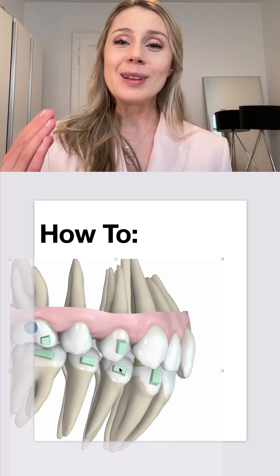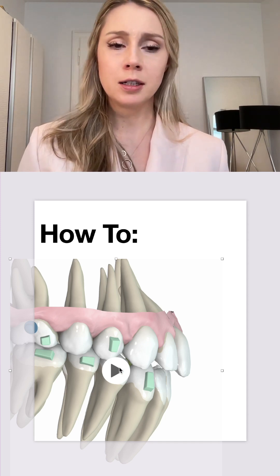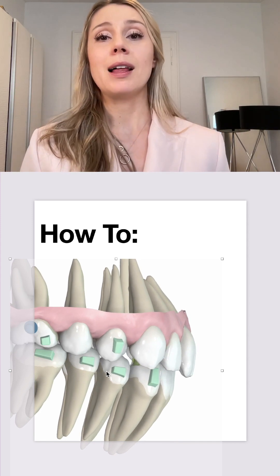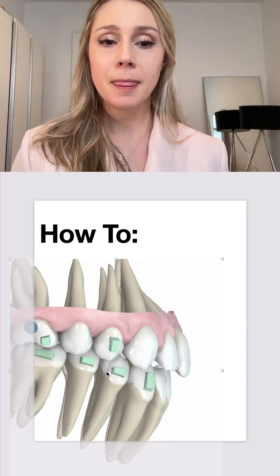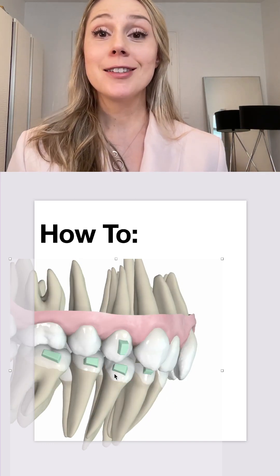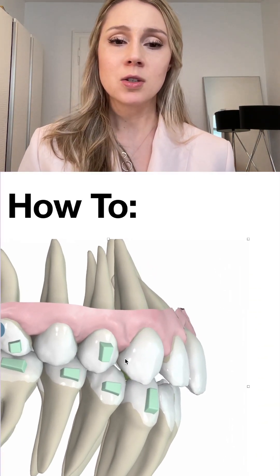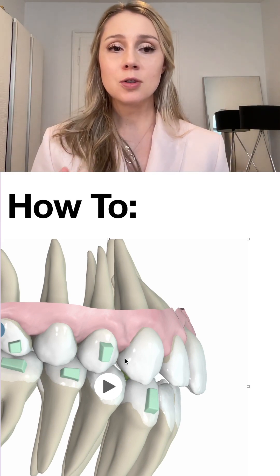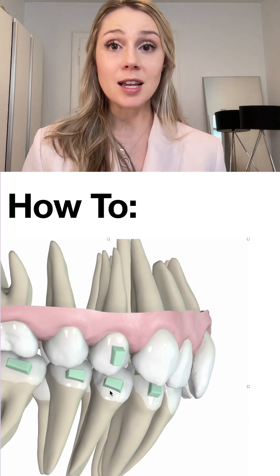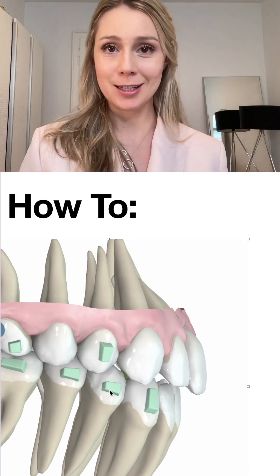I apply lingual root torque right from the start, and here is how you communicate that to your technician: if the simulation doesn't look like that, tell them to apply lingual root torque from the beginning. This is also why I love the Spark aligners approval software so much — you can see the roots, and while I'm not focused on the exact anatomy, it helps me assess tooth inclination and understand which movement is involved to reach the final position. Here, root torque is clearly involved.